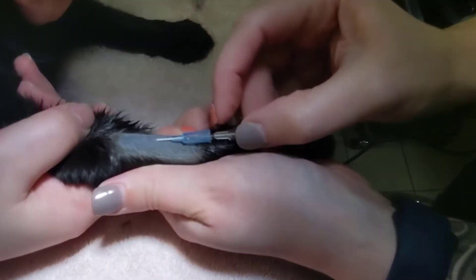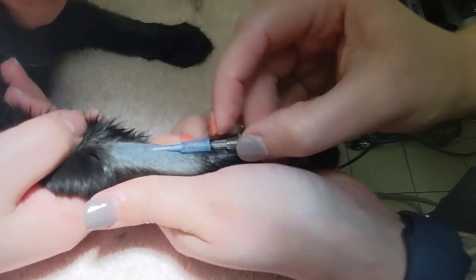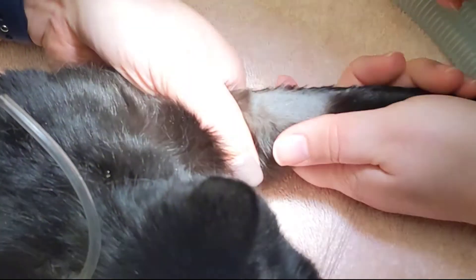Catheters should always be inserted all the way into the vein, so if you are unable to insert the catheter all the way into the vein, pull the catheter out and try again with a new catheter.